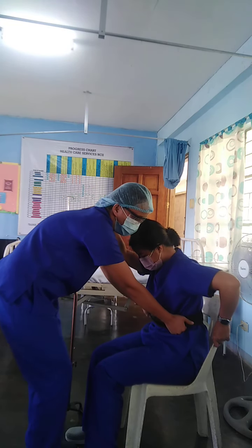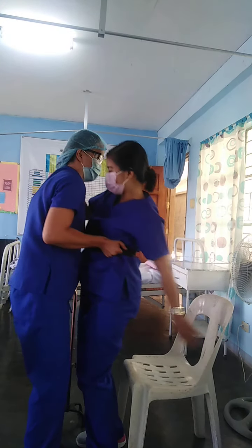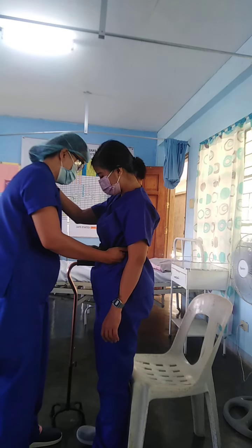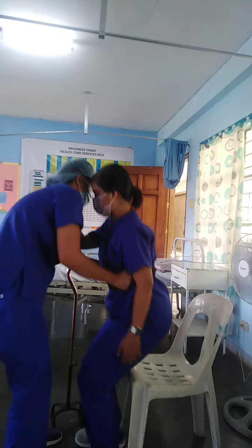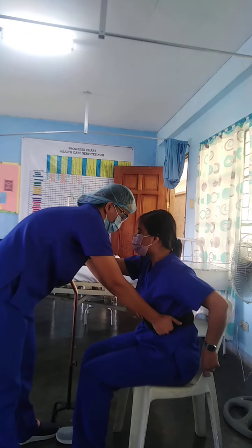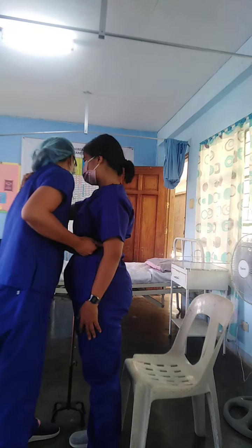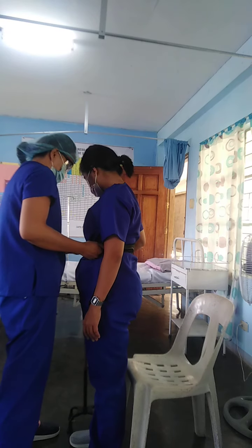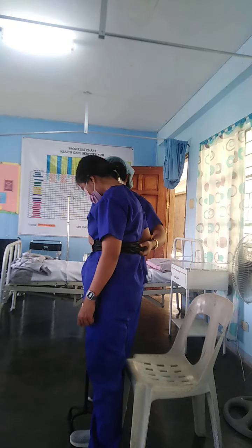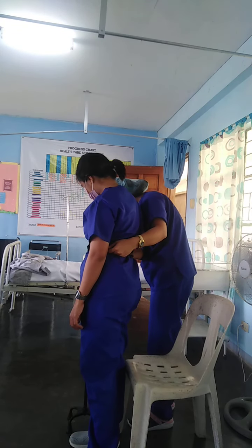At the count of three, ma'am. One, two, three. Tatayo. Spread your feet apart. At the count of three, ma'am — tatayo nga na po. One, two, three. Then, lalakad po ulit tayo, ma'am. Ganun din po ng proseso kanina.